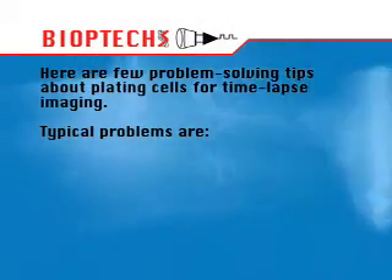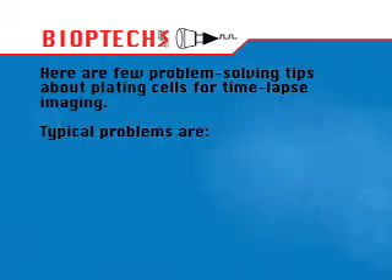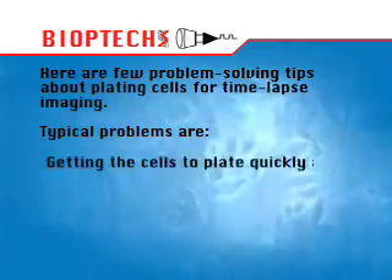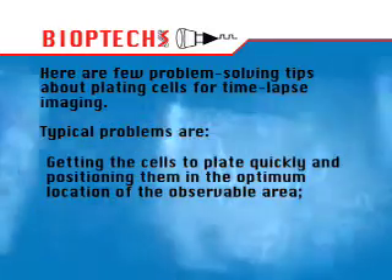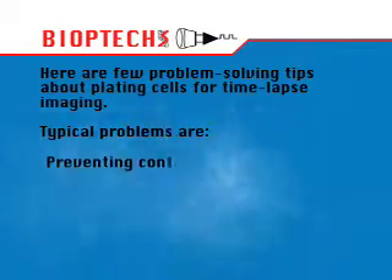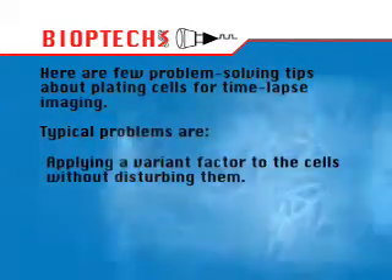Here are a few problem-solving tips about plating cells for time-lapse imaging. Typical problems are getting the cells to plate quickly and positioning them in the optimum location of the observable area, preventing contamination, and applying a variant factor to the cells without disturbing them.